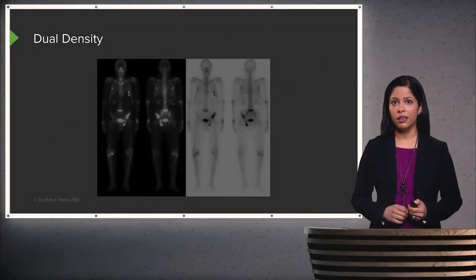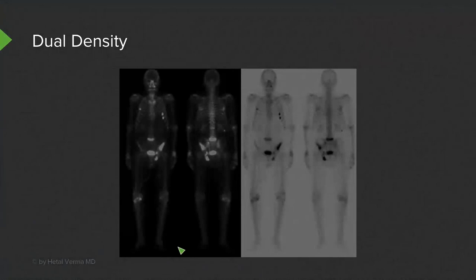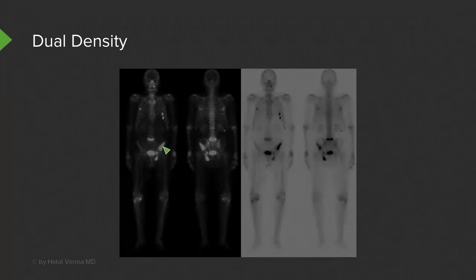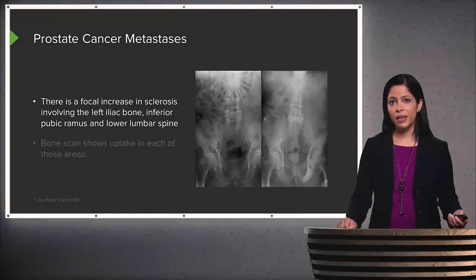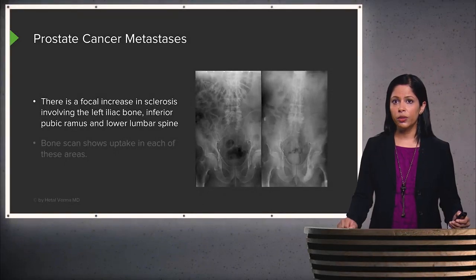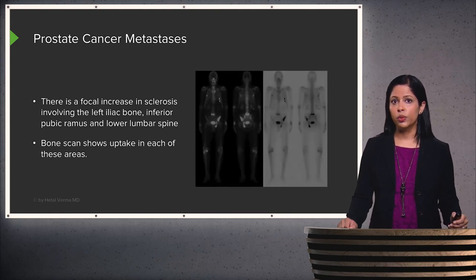This patient had a bone scan, and areas of increased bone turnover are the ones that light up on a bone scan. On the frontal image, the areas that showed increased density on the radiograph now have increased uptake on the bone scan — the lower lumbar spine, the iliac crest, and the inferior pubic ramus. Note the normal activity within the bladder. The inverted images on the right help visualize these findings better. This patient has prostate cancer metastases, and the areas of increased sclerosis represent blastic metastases confirmed by the bone scan uptake.